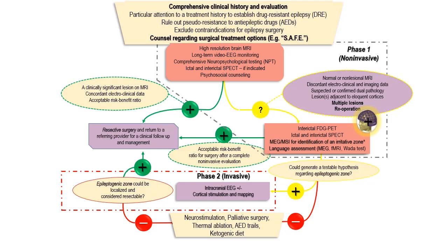Considering the effect a previous surgery can have on a scalp EEG, many experienced magnetoencephalographers believe that every epilepsy patient who undergoes a diagnostic or therapeutic resection should undergo a MEG, since it is unaffected by any skull defects from a previous surgery.